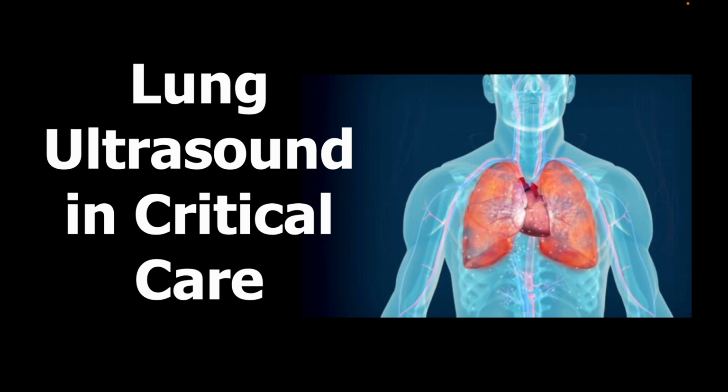Hello and welcome everyone. Today we'll be discussing lung ultrasound in critical care. So what are the basic signs and the machine settings?